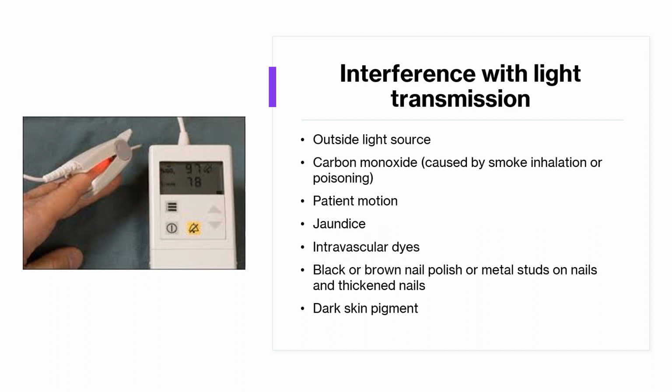That's why sometimes when we go to the hospital or the emergency room, what we need to do is look at the finger that we will put the probe on and clean that finger if there's any dirt or blood. Just use alcohol if it's not contraindicated, or just water, to clean the finger so that the probe can read the oxygen saturation properly.